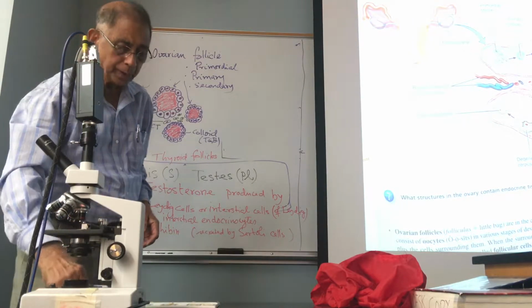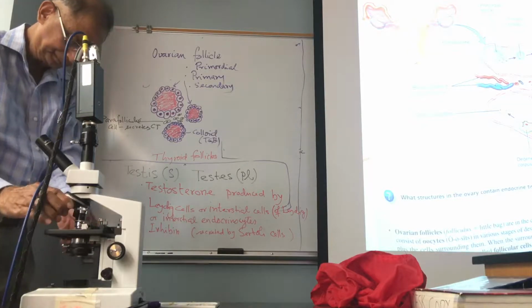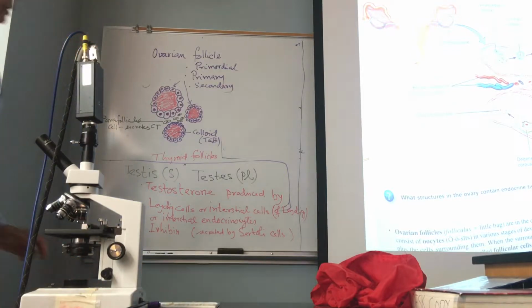The primordial follicle is a structure that is here. Look, these are primordial follicles.